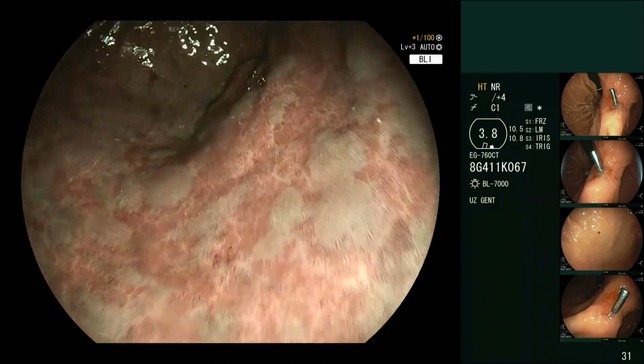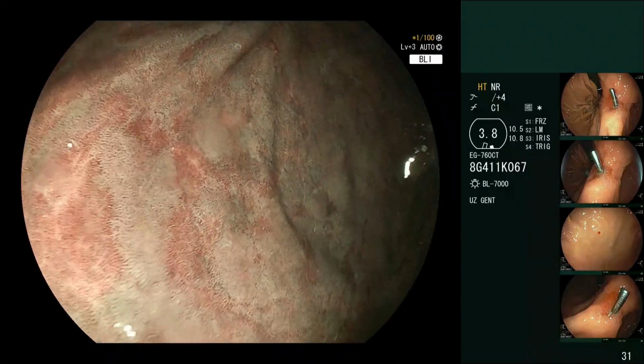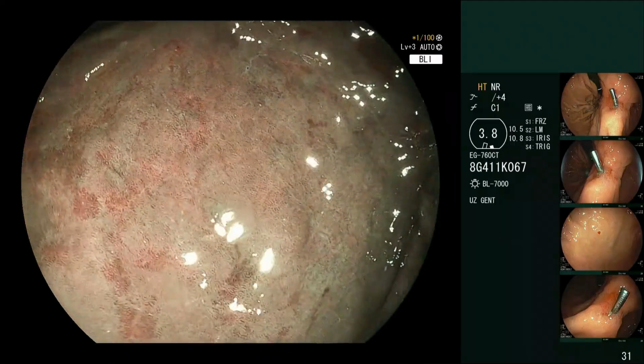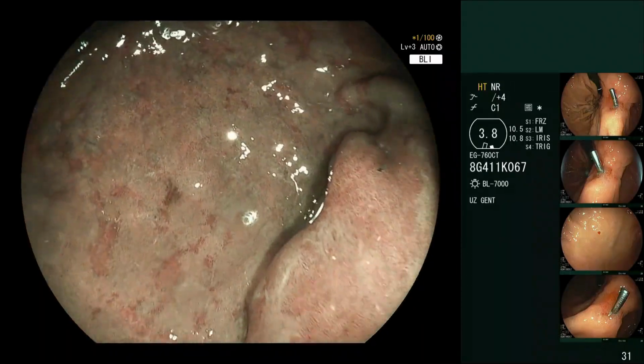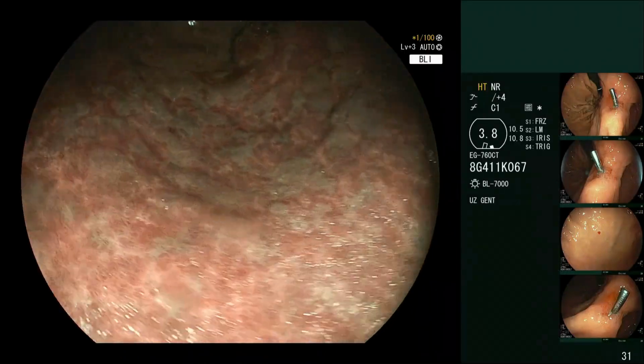And these are many, many clonal entities which all develop on their own. So this is very severe atrophy of the gastric antrum. And why is this important? Well, this is a risk factor for developing cancer, gastric cancer.